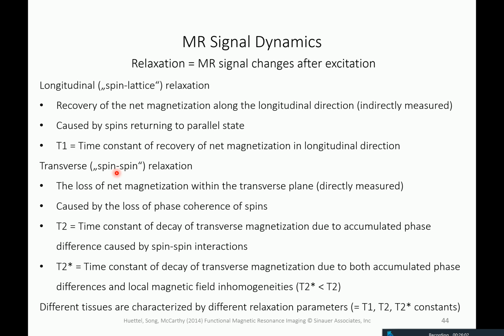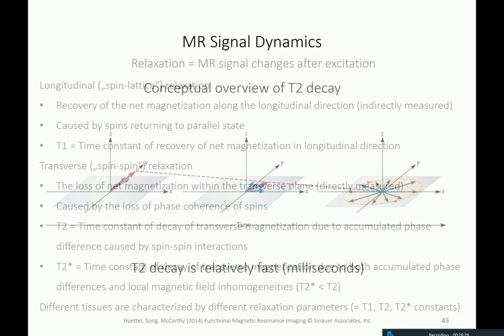So these T1 constants depend on the thing that you measure, the thing that you image, the probe or the sample or the brain, whatever you want to call it. This is important to keep in mind, that these are fixed by the probe, the sample.